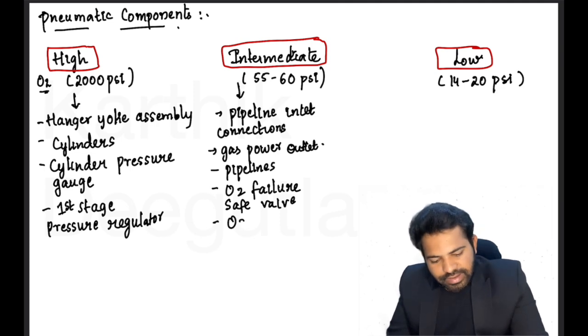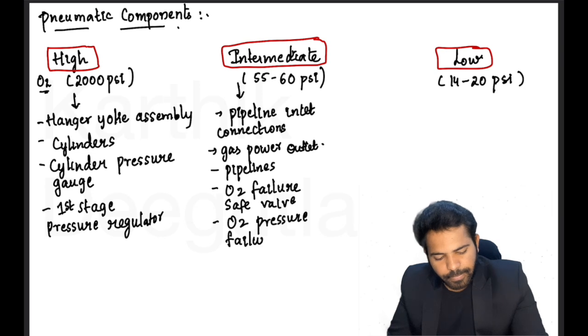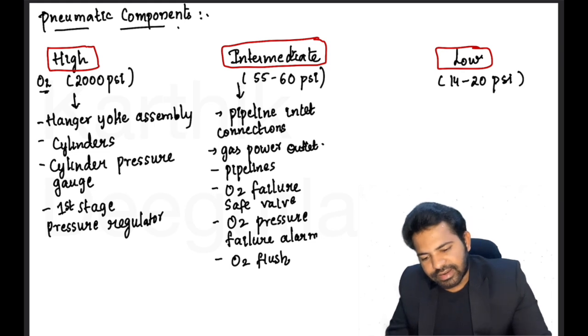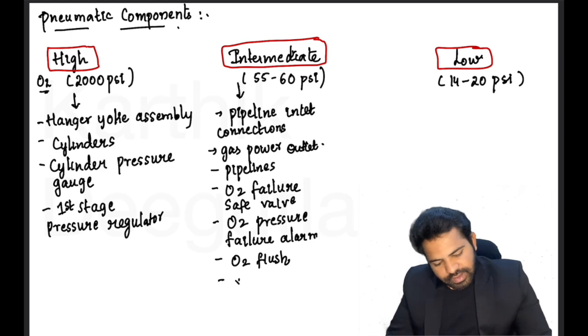Okay. Then there is the oxygen pressure failure alarm. Then there is oxygen flush. Okay, this is clear. Then we also have the second stage pressure regulator.